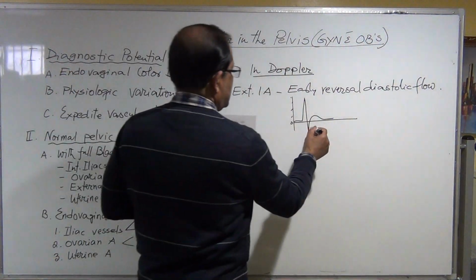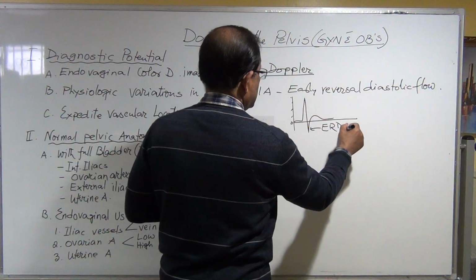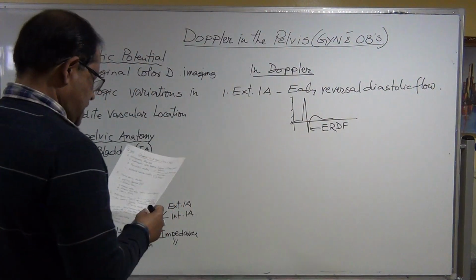Okay, so this is early reversal diastolic flow. Okay, you can see that.